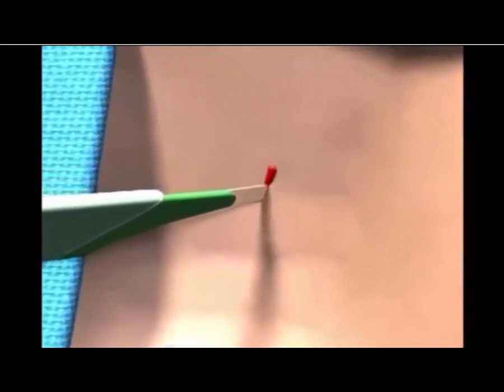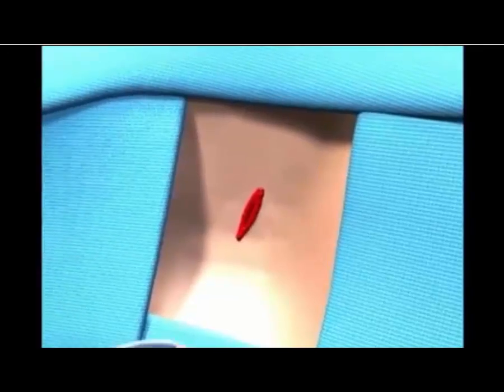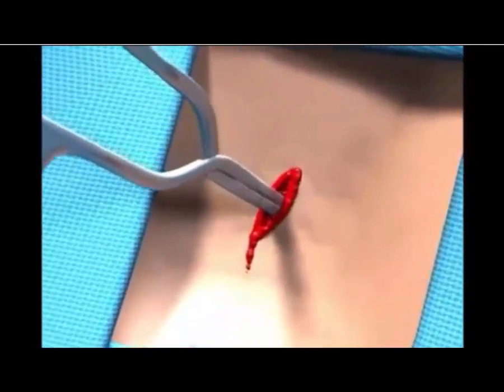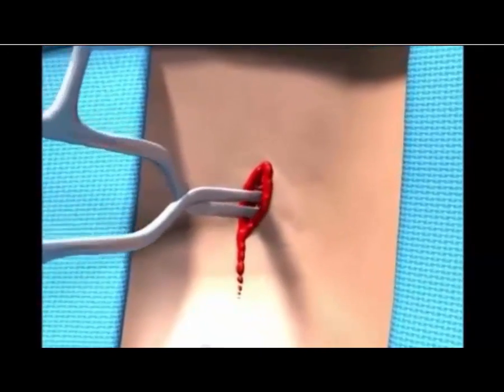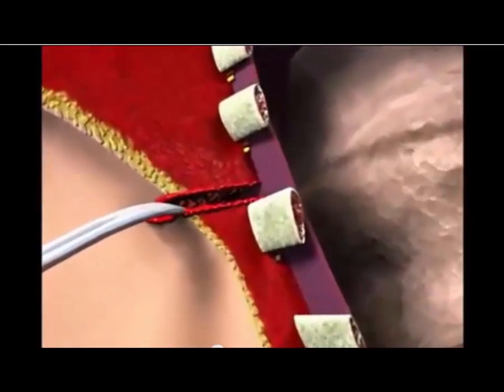Make a 2 to 3 cm transverse incision parallel to the line of the ribs at the predetermined site with the number 11 scalpel. Bluntly dissect the subcutaneous tissue with the scissors or hemostat. Dissect over the top of the underlying rib until the next highest intercostal space is encountered. With the tip of the hemostat, puncture the parietal pleura while pushing just at the top border of the rib.